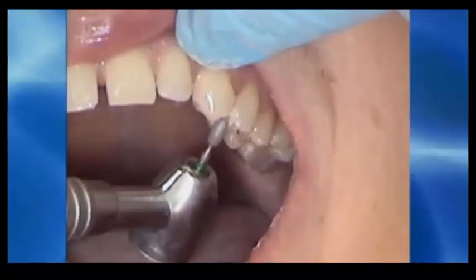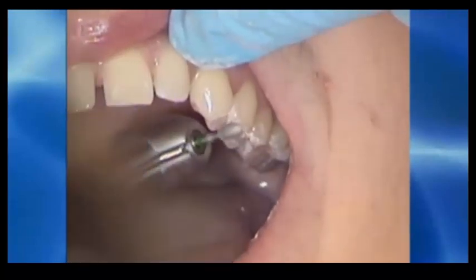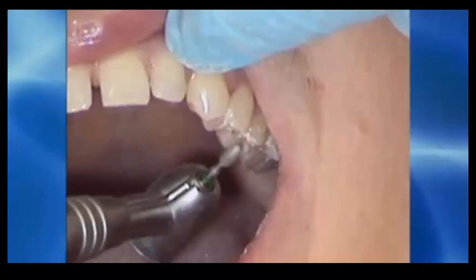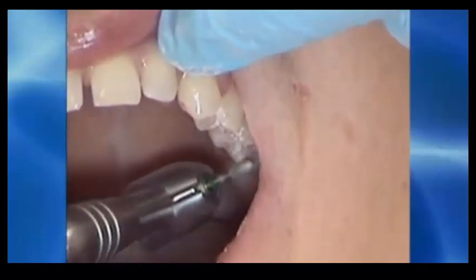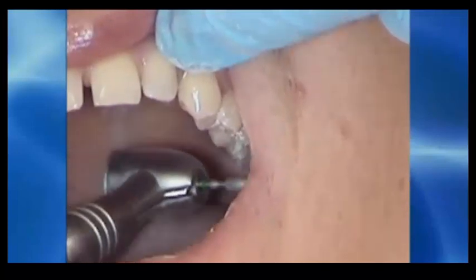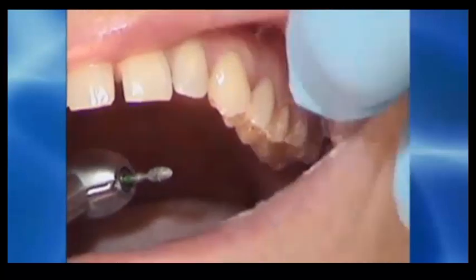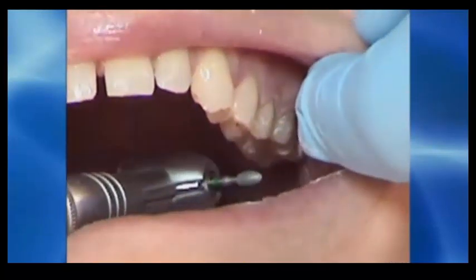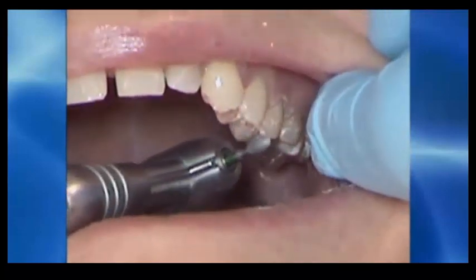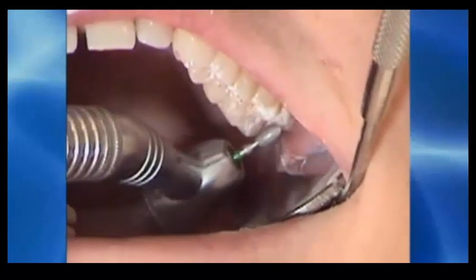The counter adjustment on the upper arch, again refining the markings that are in and around the central fossa and marginal ridge. You see I'm leaving the contacts that are in the central fossa on the first premolar. I'm trimming around that mark. I'm trimming around the cusp of the upper second premolar, and each tooth I'm looking to make the marks almost not surrounded by any slightly inconsistent marks, no scratch-like marks. That's what I'm doing here.